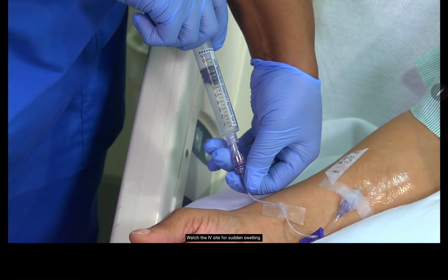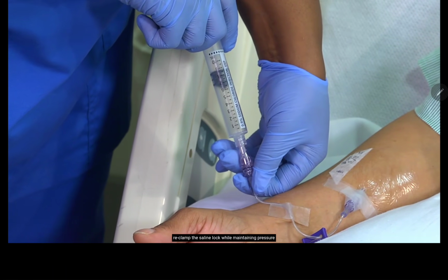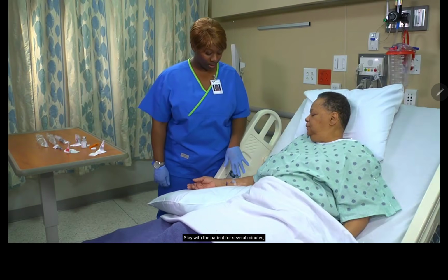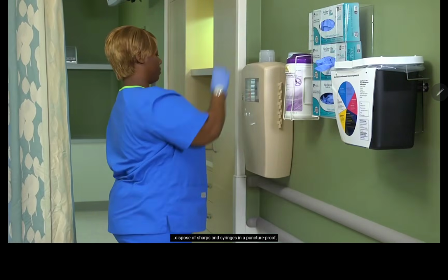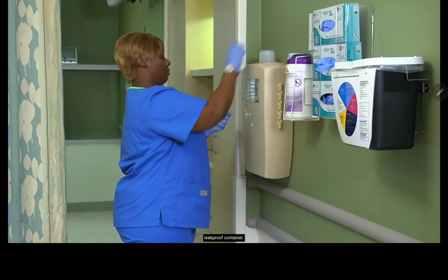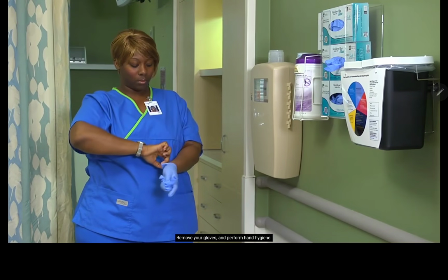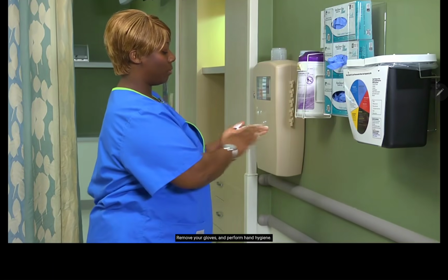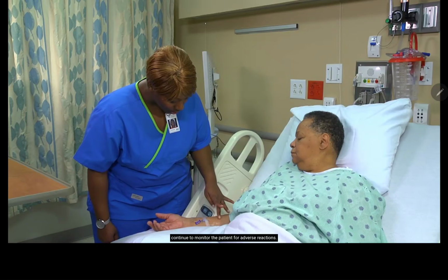Watch the IV site for sudden swelling. As you complete the injection of saline, reclamp the saline lock while maintaining pressure on the syringe plunger. Stay with the patient for several minutes and observe for any adverse or allergic reaction. With either technique, dispose of sharps and syringes in a puncture-proof, leak-proof container. Remove your gloves and perform hand hygiene. As part of your follow-up care, continue to monitor the patient for adverse reactions.